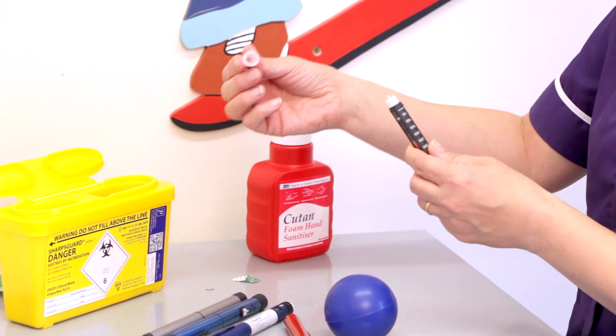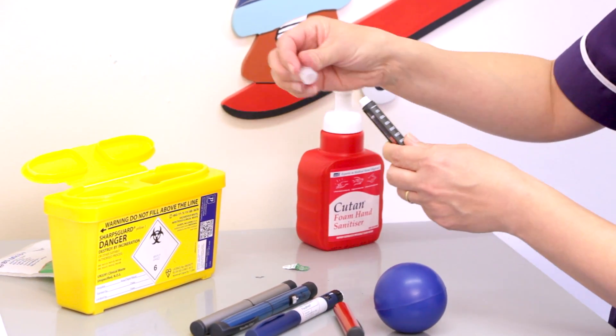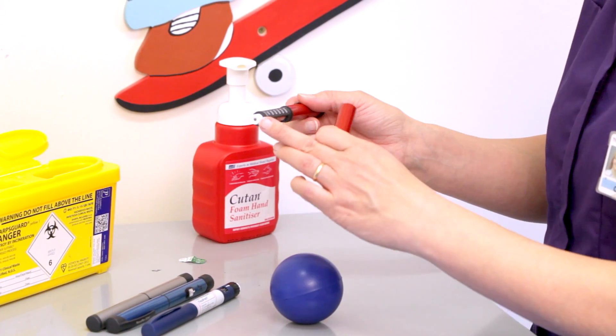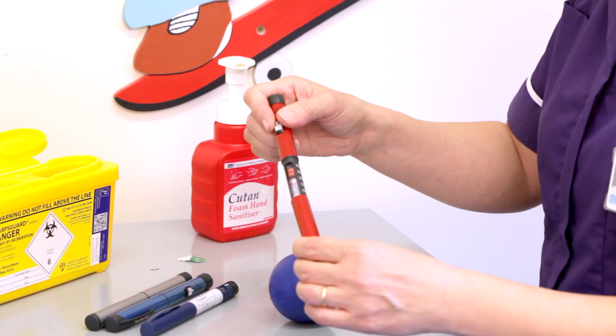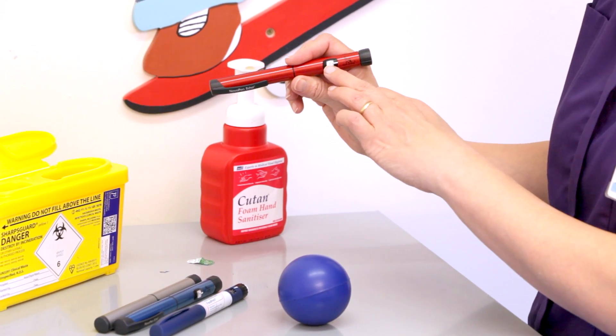Use your large cap, unscrew the needle until it releases, and then drop it into the sharps box. It's important not to store an old needle on the pen, so replace the cover. Once you've given an injection the dial is reset to zero.